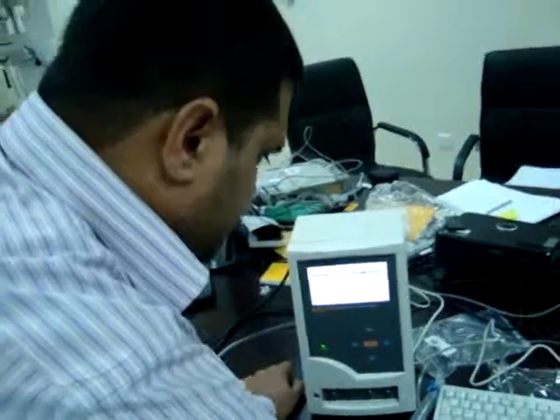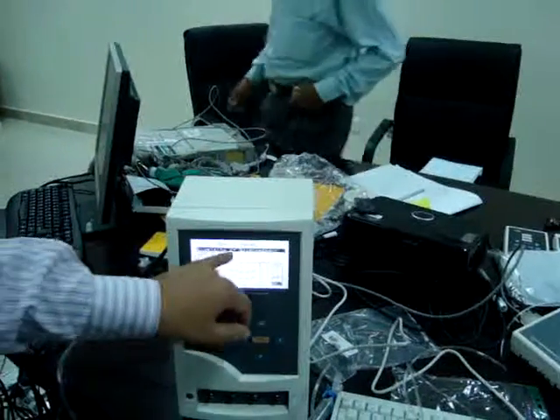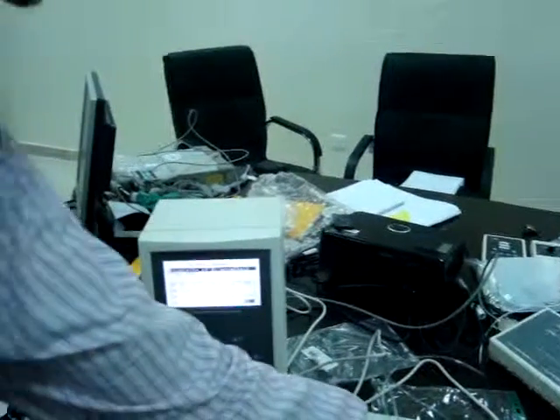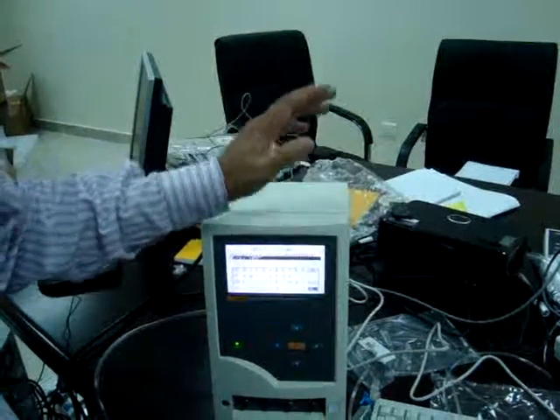Then you can program the report header, what you want on the top every time the report prints. So you can put University of Science and test, what type of test it is, 6 monthly test, final test, yearly test, whatever.